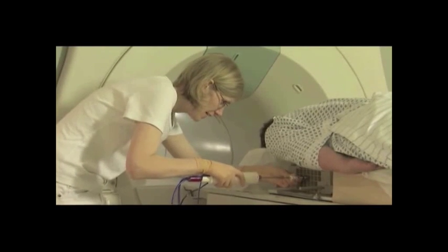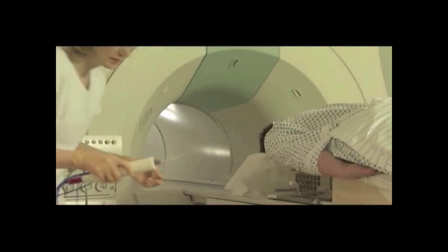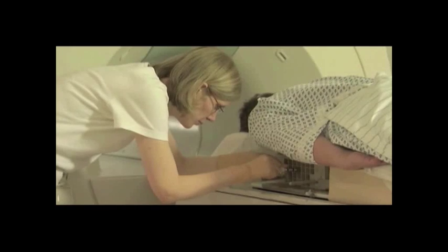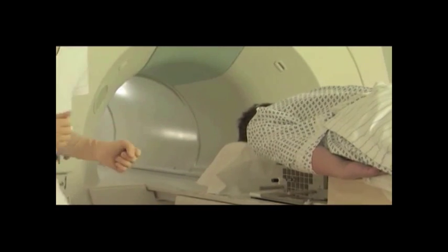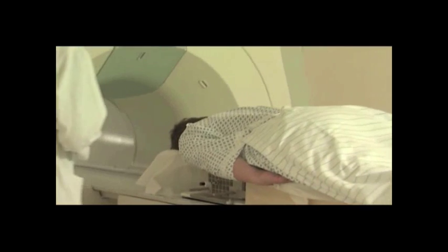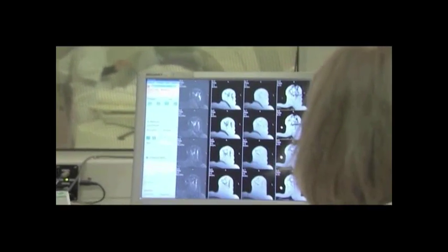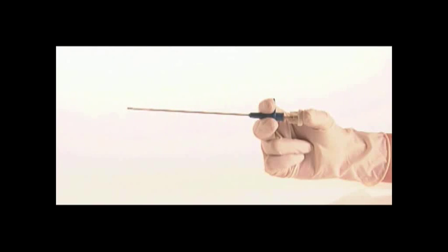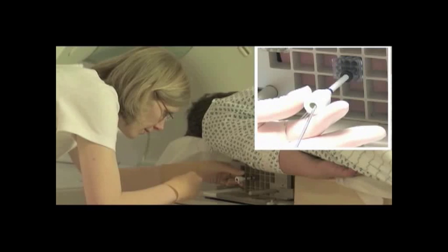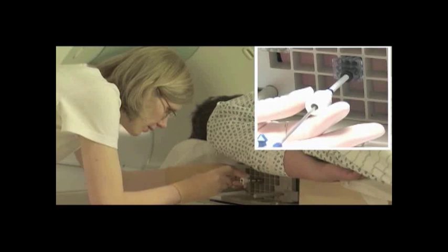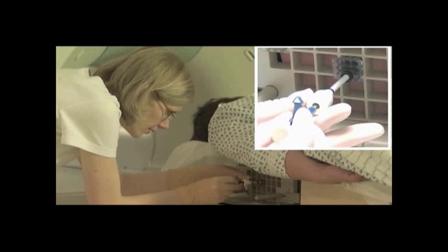Remove the ATEC handpiece while leaving the introducer sheath in place. To verify the successful biopsy of the area of interest, reinsert the localizing obturator back into the introducer sheath. Shuttle the patient back into the magnet for post-biopsy sagittal and axial image sequences. You are now ready to place a biopsy site marker. The ATEC TriMark biopsy site identifier will be used for this demonstration. Remove the localizing obturator and place the marker deployment device into the introducer sheath until the aperture indicator contacts the introducer sheath hub.